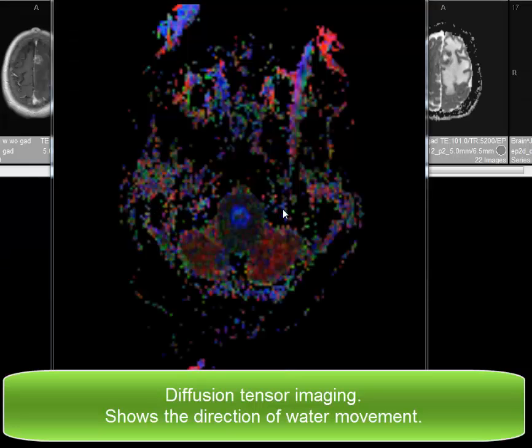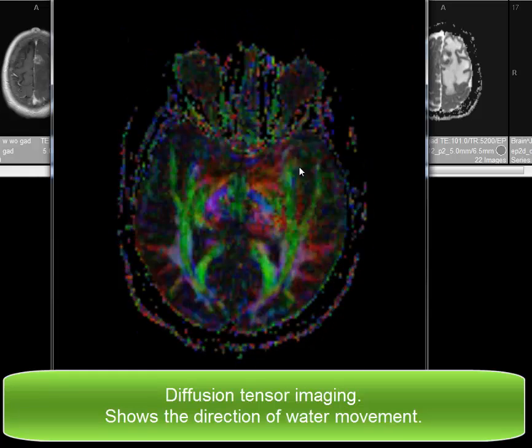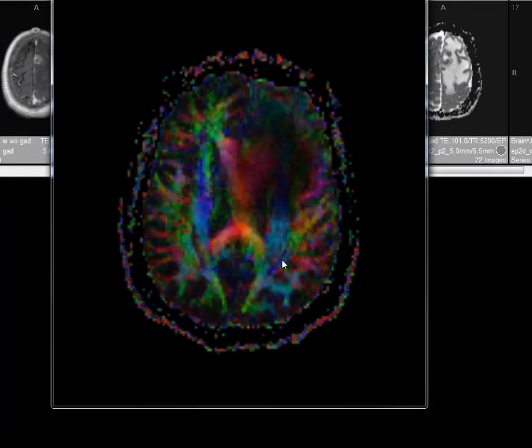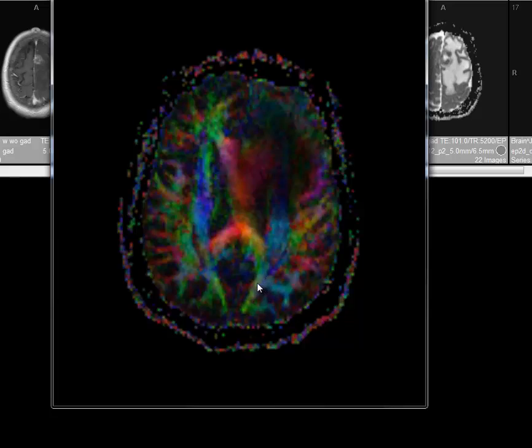The next sequence is diffusion tensor imaging. In this sequence, we are mapping the white matter fibers, which have different color encoding depending upon whether they are going in an AP direction, right to left, or up and down. Water protons cannot diffuse equally in all directions, which gives what we call diffusion anisotropy. The diffusion tensor imaging maps show white matter tracts using this anisotropy.